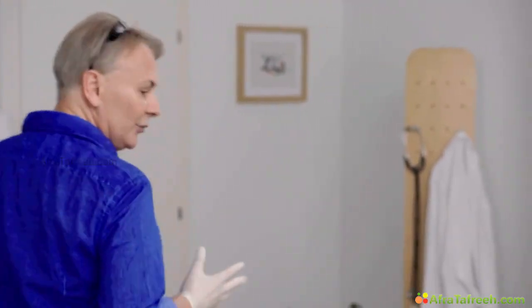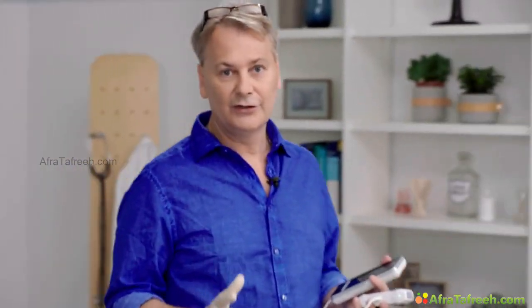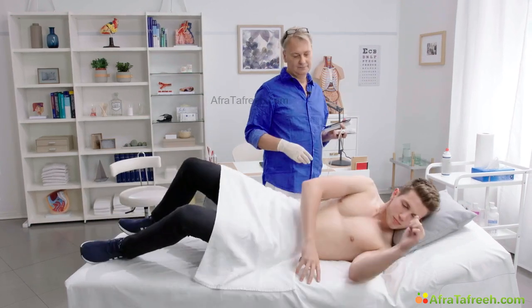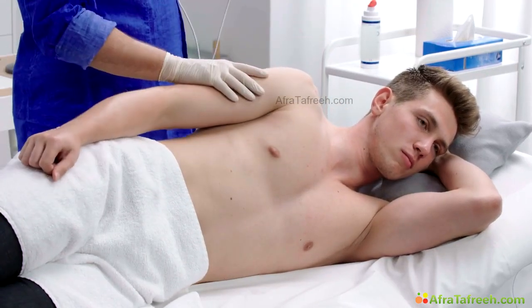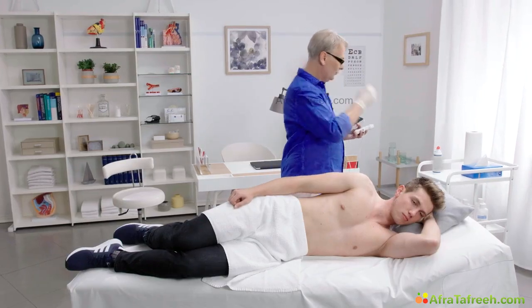Now, in principle, when you image, the very first thing you have to do is position the patient so that you can get a very good image. And you have to position the patient extremely on his left side, especially if you image from the parasternal window. So that's what we're going to do. Can you turn to your left? The left hand should be above the head, and the right hand should be closely attached to the chest. Then we need some gel.